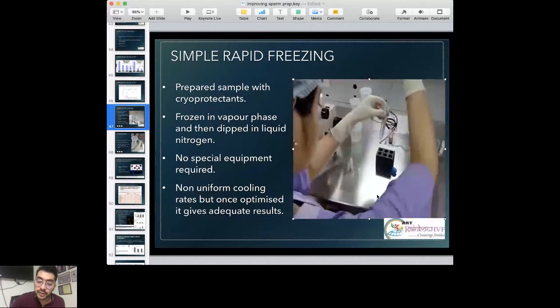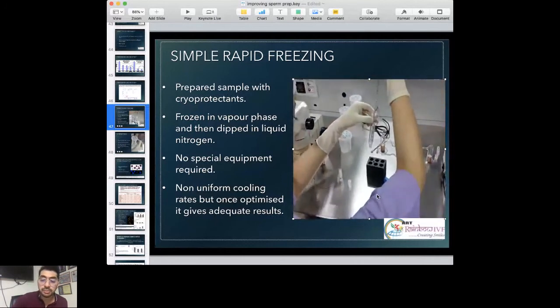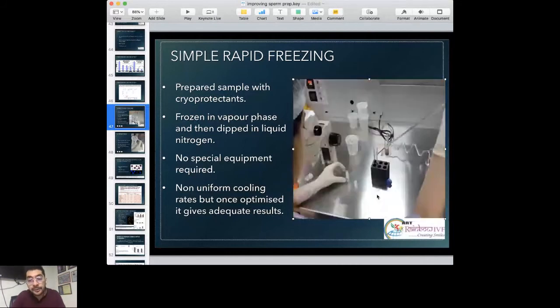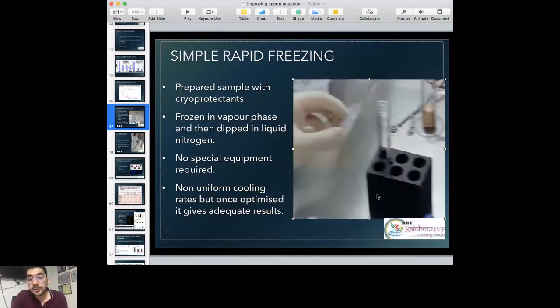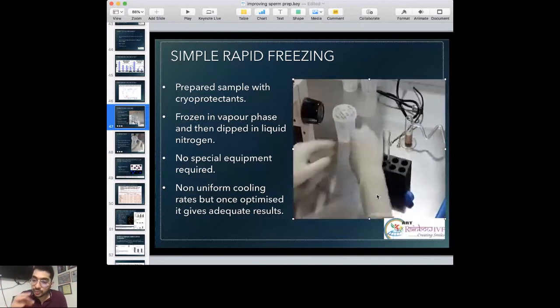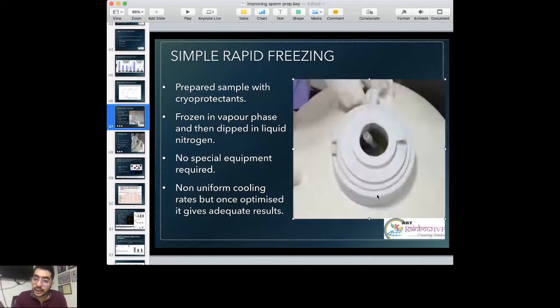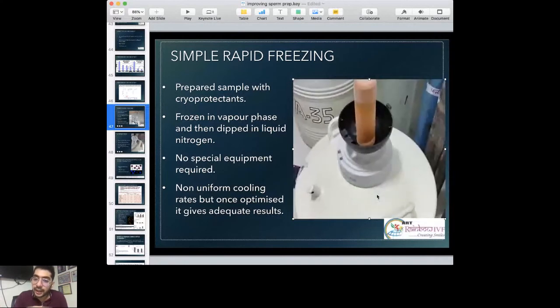For Tejal, I think your question is for HOS. Yes, it can be used for ICSI. You just use a HOS media which is available from the market. I would not recommend preparing your own HOS media in the laboratory, because this is human IVF. You are not experimenting in the laboratory. So just prepare an approved HOS media and make a droplet out of it. You mix the sample in the media and create those droplets in your ICSI dish as well, right? Then just pick up the coiled sperm from the HOS droplet, wash it in PVP once, and then inject it.